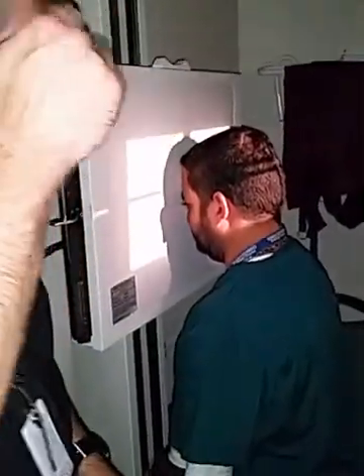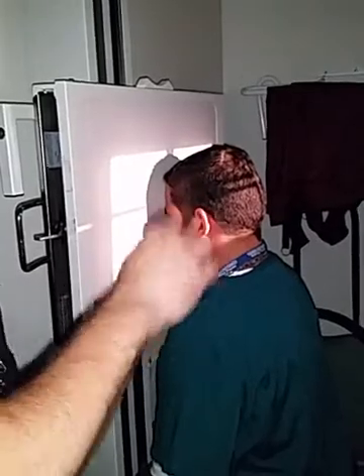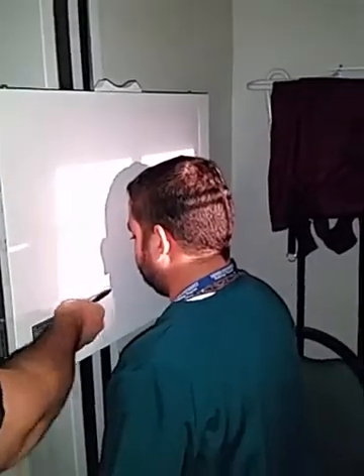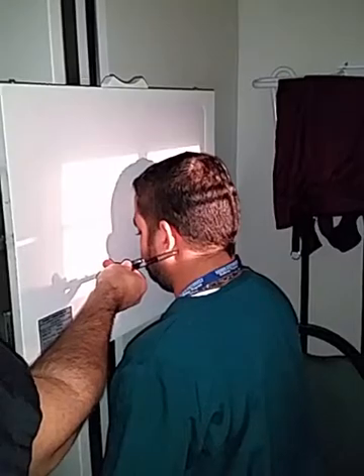If you don't see that mastoid tip, you are clipping the base of the skull, which means you need to open up your collimator. Do you want to see it again? All right, see here's the bottom of my light field. Definitely within the light field. Okay, so I like this collimation, it's pretty good.